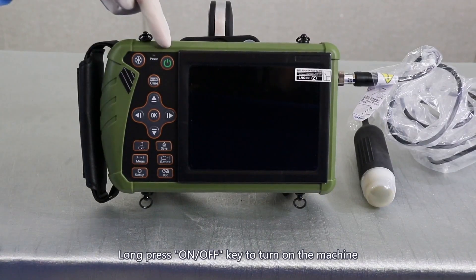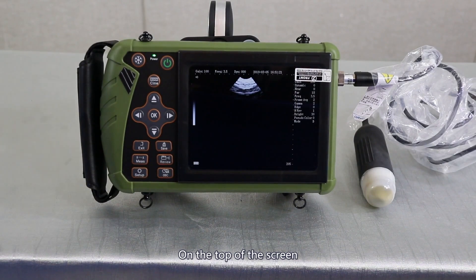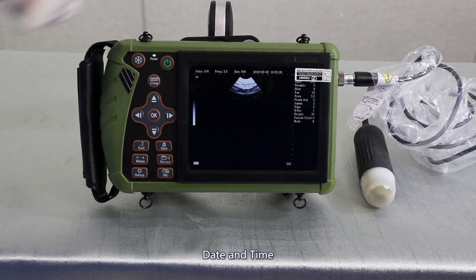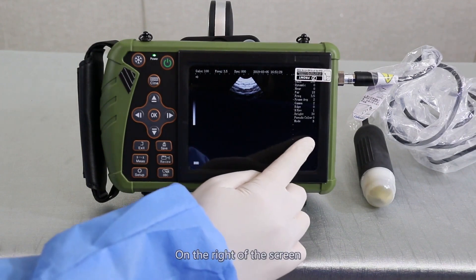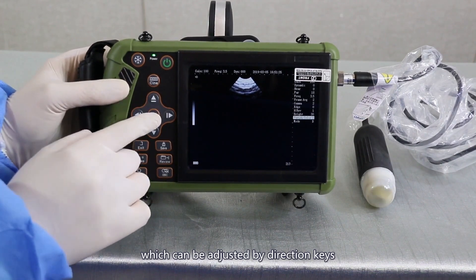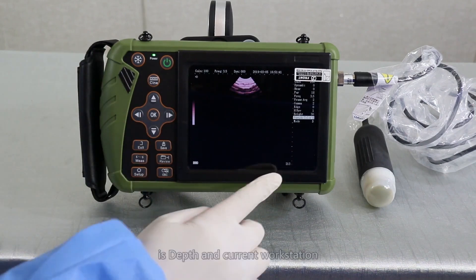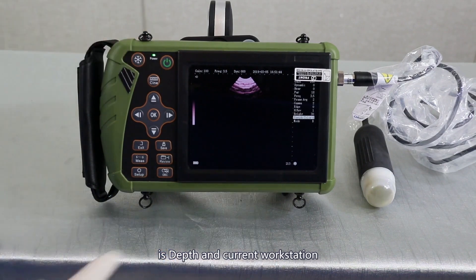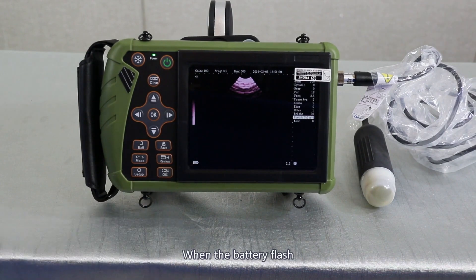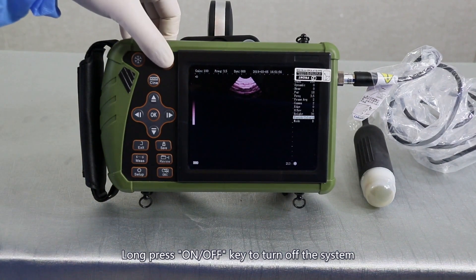Display interface. Long press the ON-OFF key to turn on the machine and enter the operating system. On the top of the screen is the gain, frequency, dynamic, date, and time. On the right of the screen are the current parameters, which can be adjusted by direction keys. On the right below is the depth and current workstation. On the left below is the current battery level. When the battery flashes, please shut down and charge it. Long press the ON-OFF key to turn off the system.